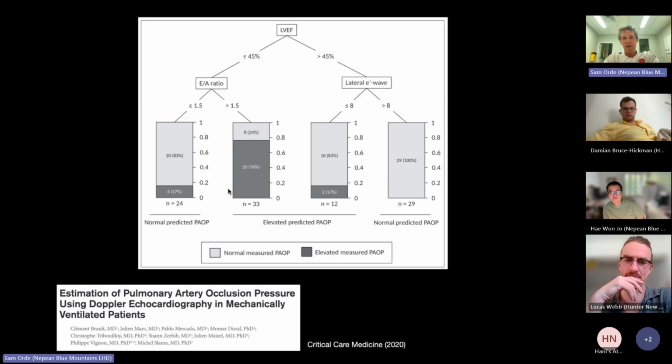Again, what I find a trouble with this is we're looking at a static parameter and we're not doing repeated measures. So, clearly you can see from the curves here, and again, it's not perfect, but it's nice that we're trying to simplify it down a little bit. And I think with the repeated measure, you can actually then make this super useful and tell you which group you're in with a lot more certainty.